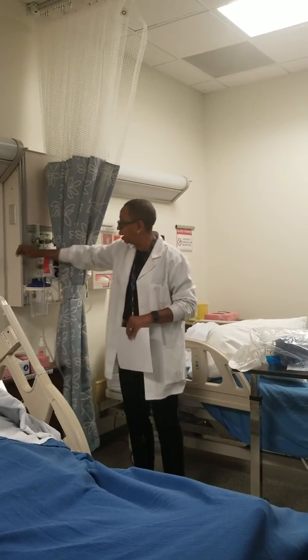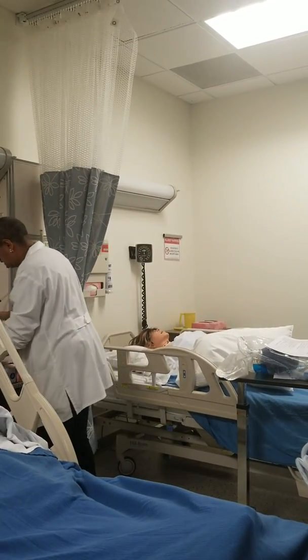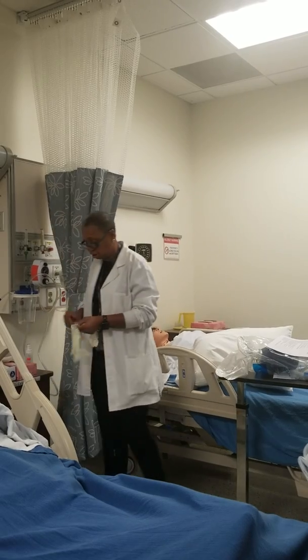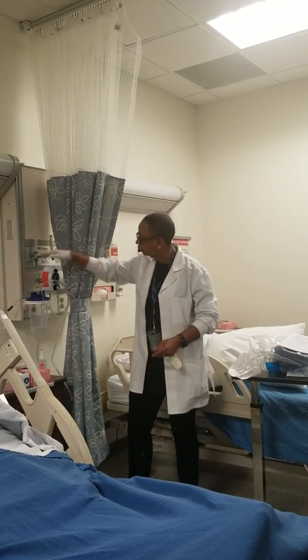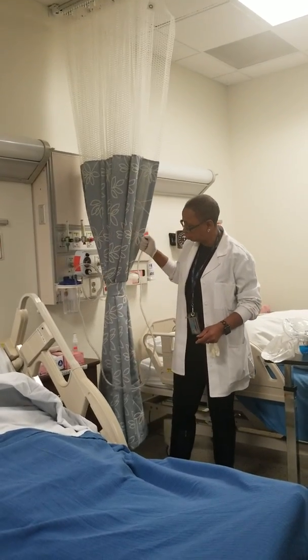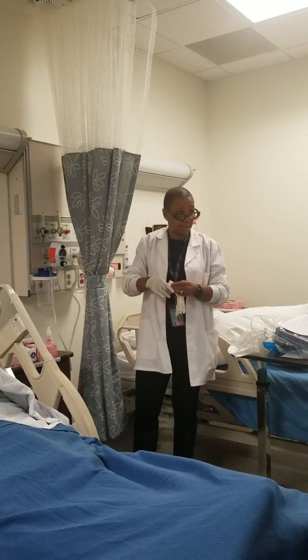I should put on gloves because this is probably dirty by the end. So put your gloves on because of these secretions. Go ahead and test that and make sure it's working. I didn't turn it back on because it gives everybody a headache. Y'all kind of get what it sounds like.